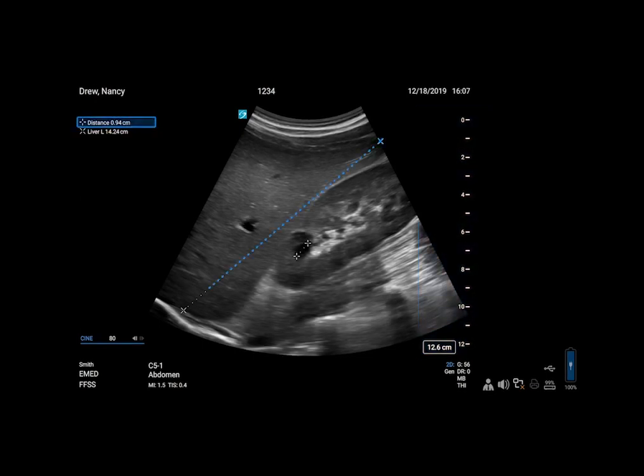The clinical monitor displays your image, depth markers, calculations, and measurements. It also shows patient and clinician information, as well as study details and the system status icons.